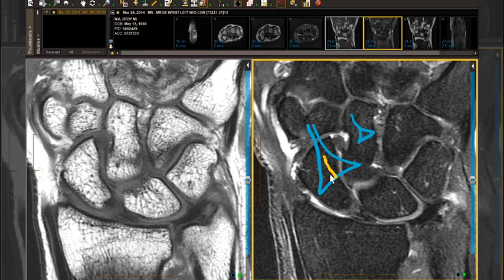Now that can be particularly confusing. But one thing that will help you, look at the joint. First of all, this cleft will be pretty symmetric. It usually won't be off eccentrically to one side or the other, and the joint will still look pristine. So when you have these clefts, which are common in the LT ligament, look at the LT interval for supportive evidence.